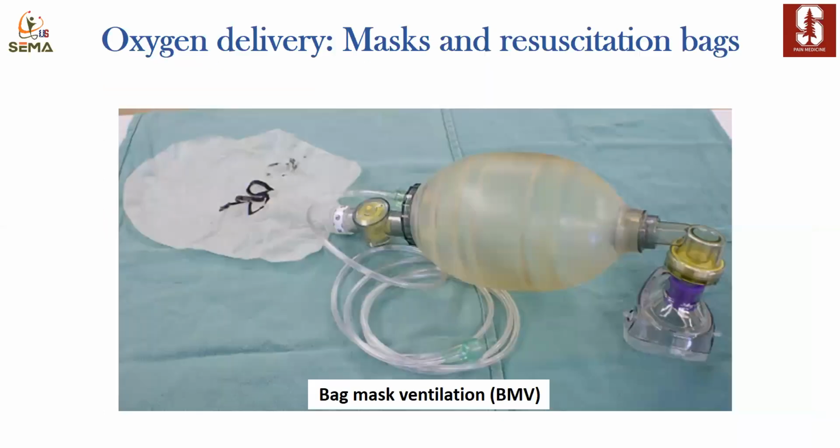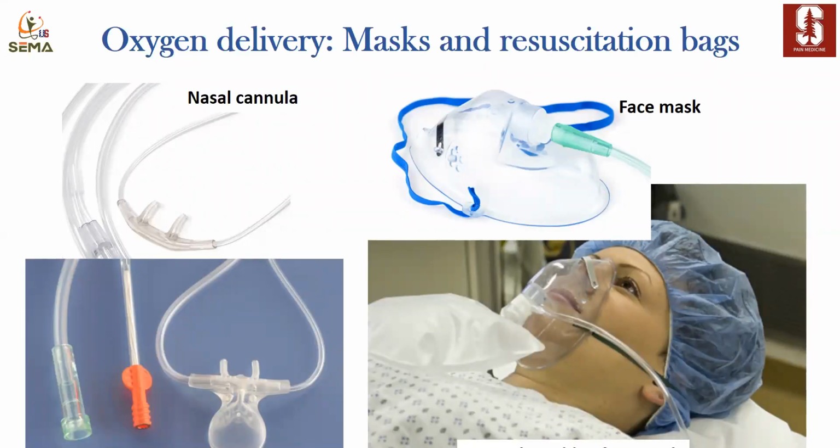The reason why it's important to distinguish between them is that each one of these is capable of giving you a different FiO2. So if you go to the patient and you see the patient, for example, on nasal cannula versus partial non-rebreathable face mask, that will tell you how hypoxic or hypoxemic this patient is, and will tell you how much time you actually have.